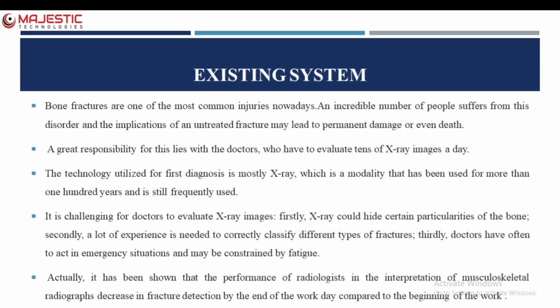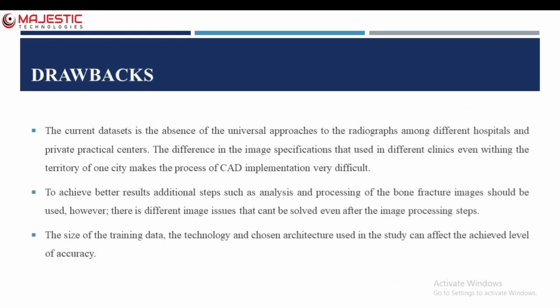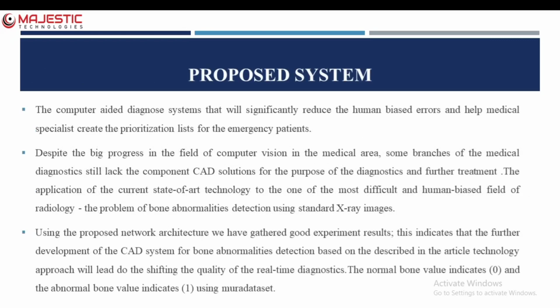The drawbacks are the current dataset, and the absence of universal approaches to the radiographs among different hospitals and private practical centers. In the proposed system, with the network architecture, we have gathered good experiment results. The MURA dataset was used in this project.